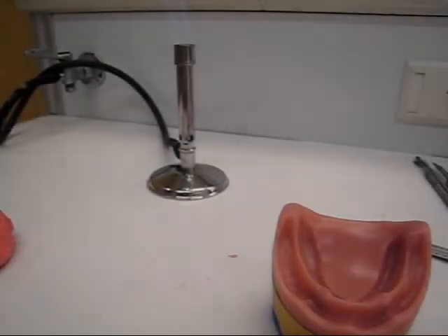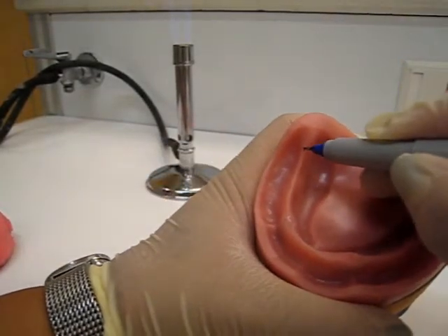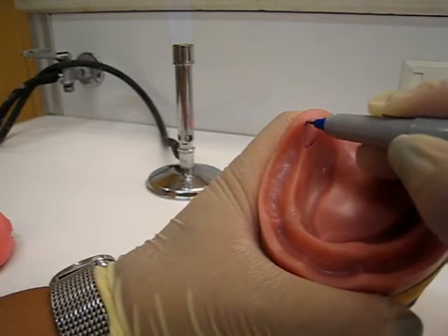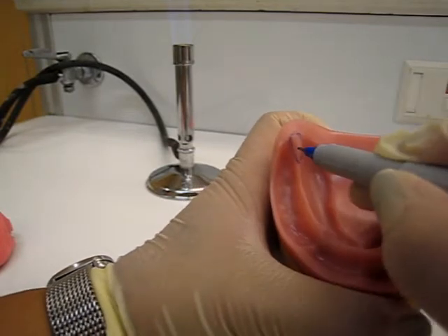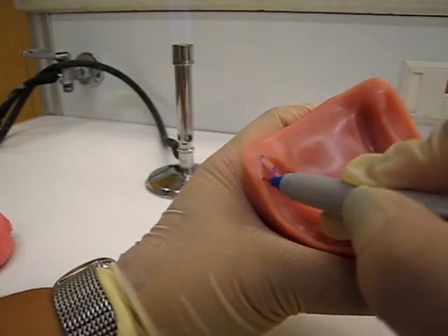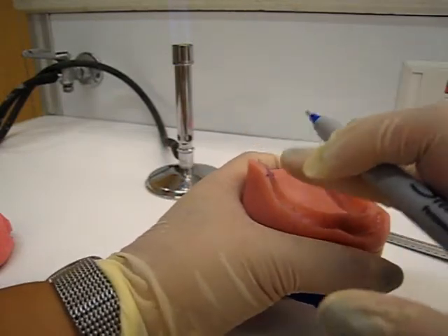Now I think would be a good time to go over the markings that you need to make on your cast. The first thing you want to do is circle the retromolar pad - it's like a pear shape. Mark halfway and then bring it out. This is going to be the height of the occlusal rim.